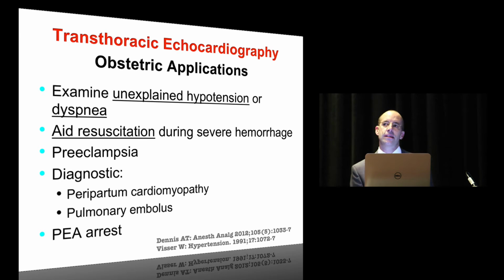It can help in the diagnostic setting. You need a little bit more of a skill set, but you can see cardiomyopathies, PEs with right-sided heart changes, and I'll show you some examples of this.